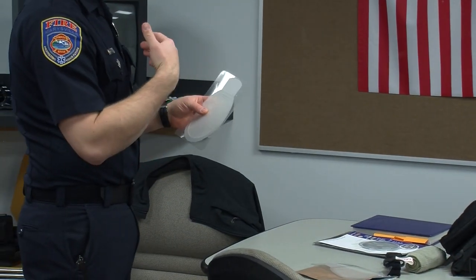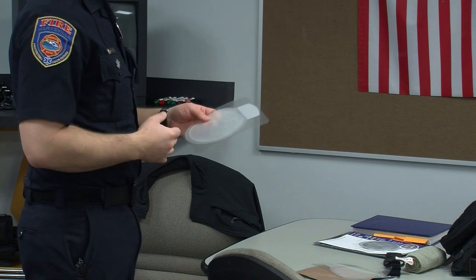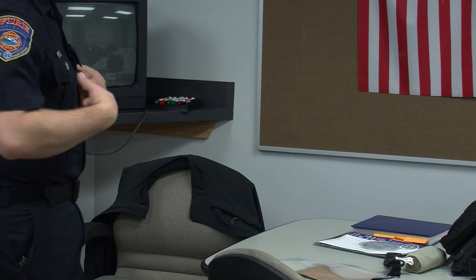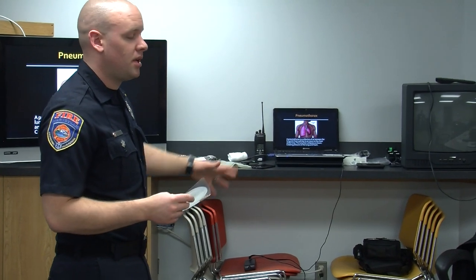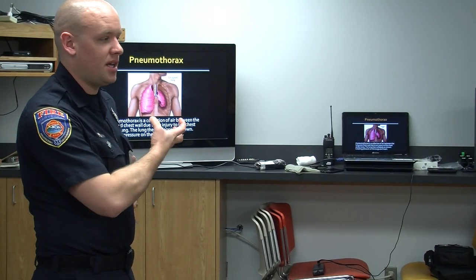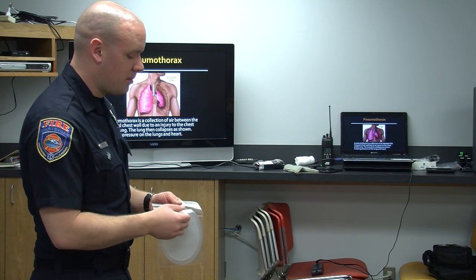Any penetrating trauma, gunshot wound, stab wound, whatever, from the neck to the navel, should get one of these. Okay? Because when you breathe, your diaphragm drops down, pulls negative pressure on your lungs, and draws air in through your nose and your mouth. So if I've got penetrating trauma anywhere, even if it's not a big, huge, gaping wound, it can pull air or blood from that area into the chest cavity. Then I start to fill up the chest cavity with air, blood, whatever, put pressure on the heart, pressure on the lungs, and create a lot of problems. So if I can seal it up with this thing, it can't pull that through there. Is it going to pull some blood in there? Probably. But it just lessens the chance of making it much, much worse.